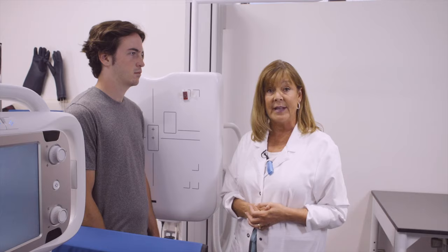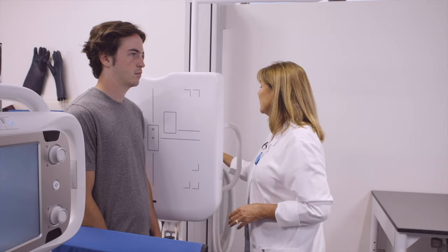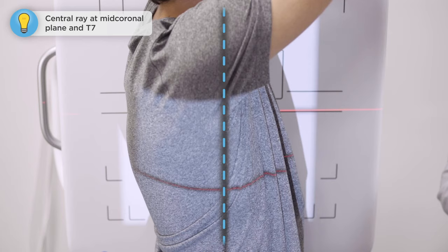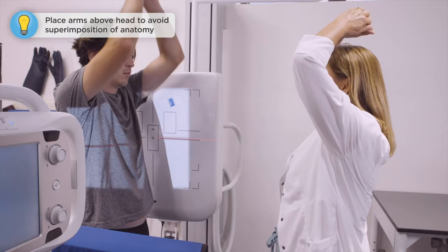We're going to take the right marker off and use the left marker to indicate the left side of the body in the anterior. His arms will go above his head. Our central ray is going to use the coronal plane and we're still at T7. Can you lift your arms above your head and pull your elbows in so that your side is really close to the board? I'm going to pull you forward just a little bit.